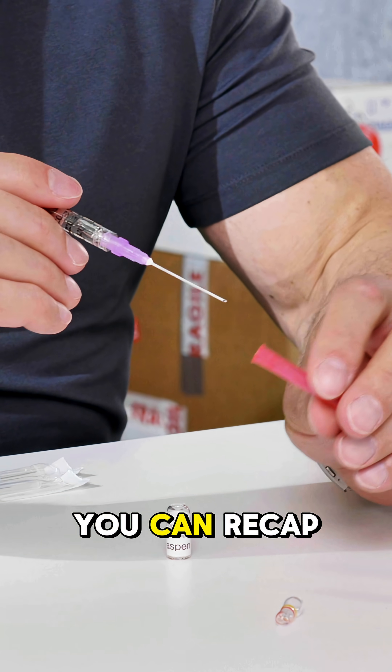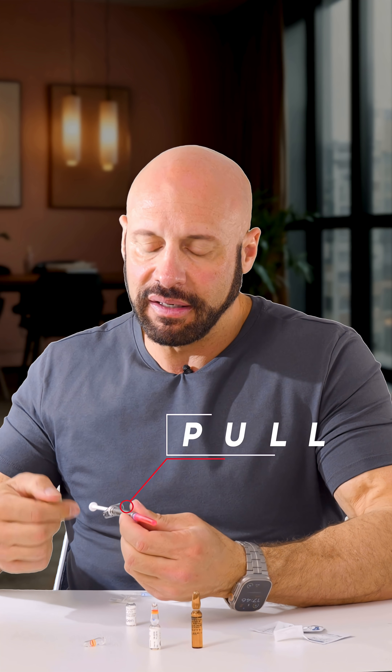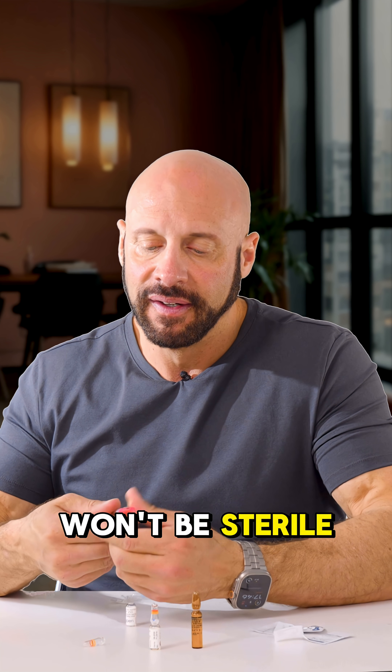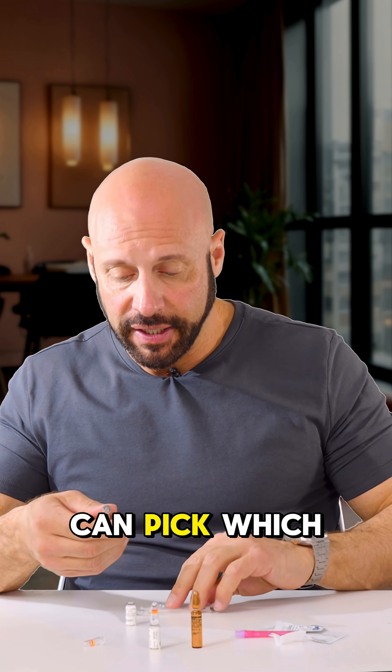What you'll do is recap it. There's really no more room left, so you can't pull back any further because you risk the plunger coming out — you don't want to do that. Because it will no longer be sterile, you can unscrew the needle filter.